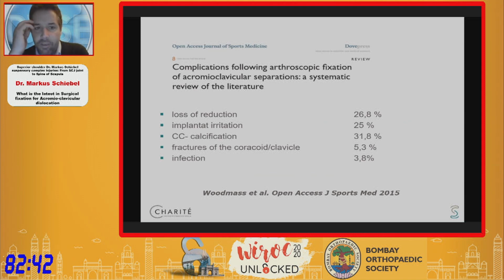What about complications? We know that these fixation techniques, even if you do them arthroscopically, have 3 to 4 major potential problems. Loss of reduction, even if you do a perfect job, around 25%, 27%, they migrate up a little bit superiorly or posteriorly. Implant irritation, with the strong fiber wires on top of your plates. So in a substantial cohort, you might have to remove these implants due to pain over the superior aspect of the clavicle.